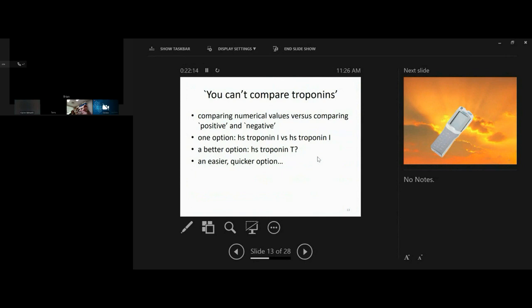So if you think there's an interference affecting your troponin assay and you want to compare it with a different assay, how do you choose the alternative assay? Well, there are a lot of different high sensitivity troponin I assays around, so that's an easy option. And it's possible that a macrotroponin will be detected by one high sensitivity troponin I assay, but not another. In fact, if your lab has an Abbott Architect high sensitivity troponin I assay, as we do in the north, then this is a good option because our assay seems to be particularly prone to detecting macrotroponin.